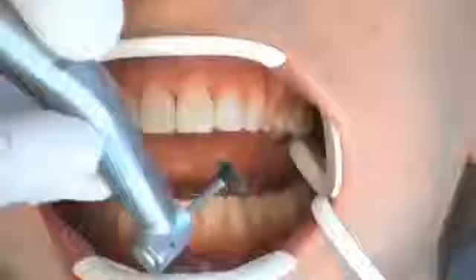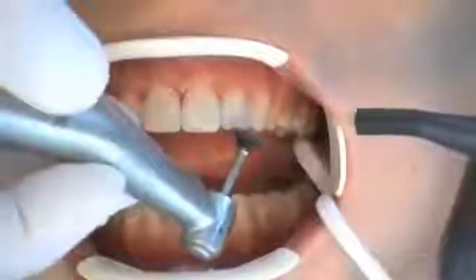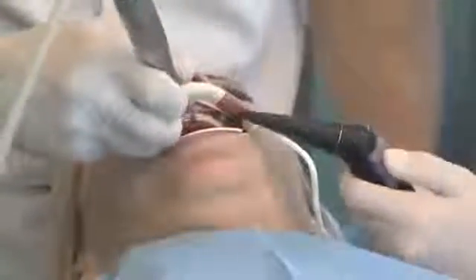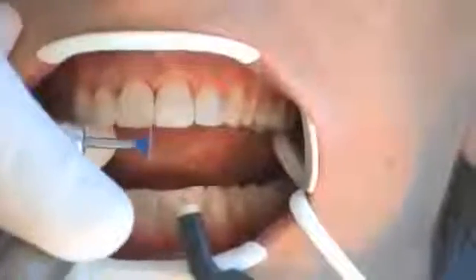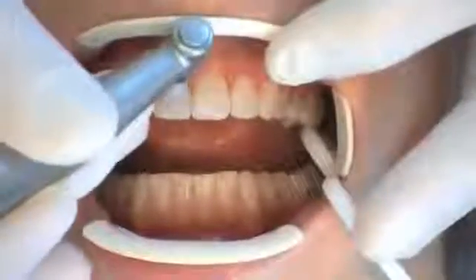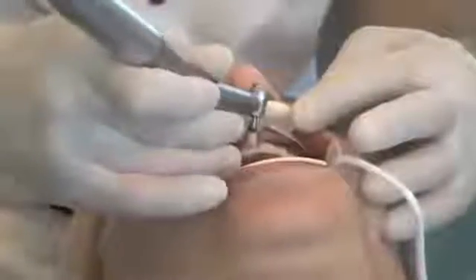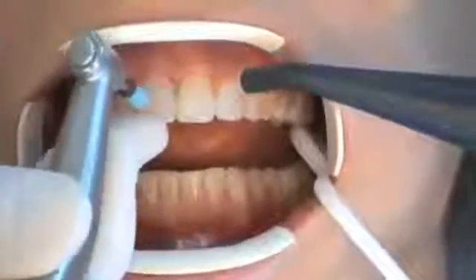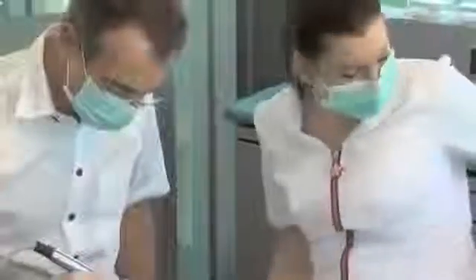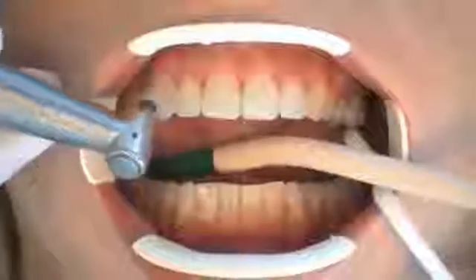Lengths and contours are corrected with slow RPM coarse discs after polishing the marginal areas. Thin discs are suitable for the interincisal angle. The marginal ridges are contoured by bell-shaped pre-polishers and high-gloss polishers with air cooling. Tapered polishers are used to accentuate mamelons or to smooth out structures.